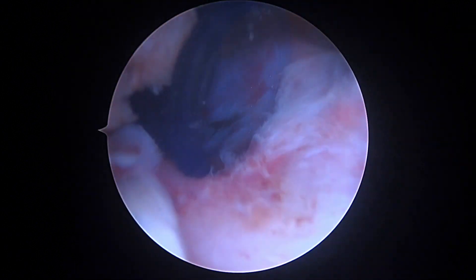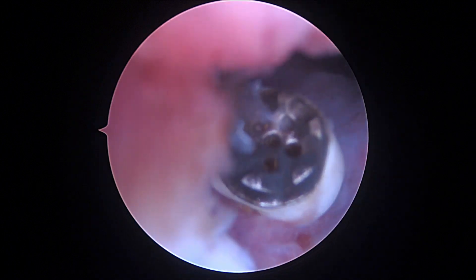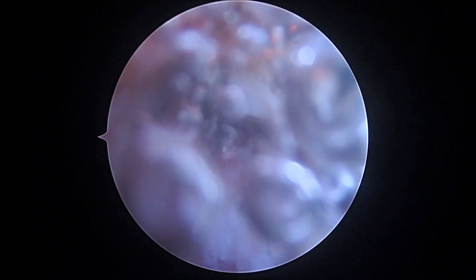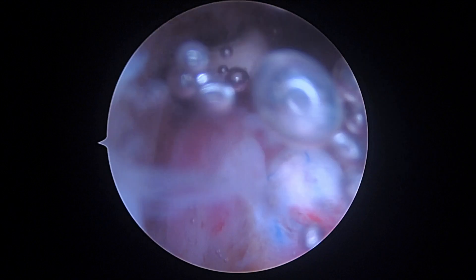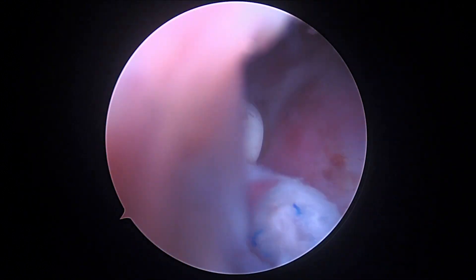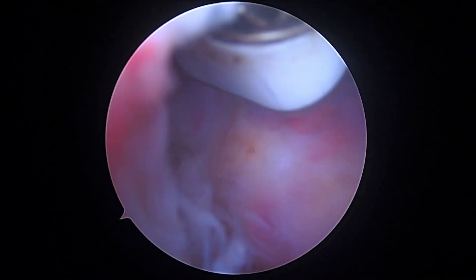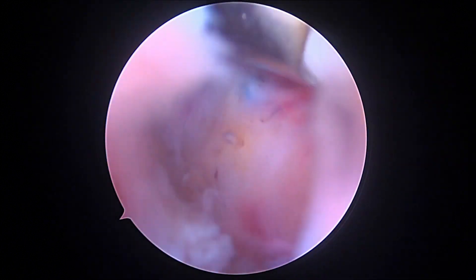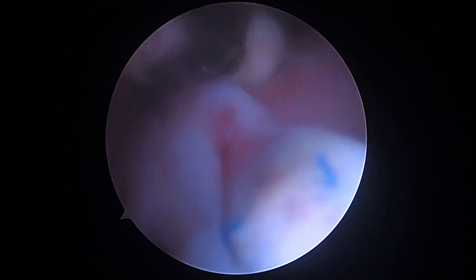Now as we look here, the camera is in the lateral portal. This instrument you see here is coming in from posterior. We're going to start from the back and work our way forwards. I think you can see the same suture I'm pointing to — right there — that looks pretty good. You can see how it starts to synovialize, which is just a fancy way of saying it starts to get covered up with soft tissue.